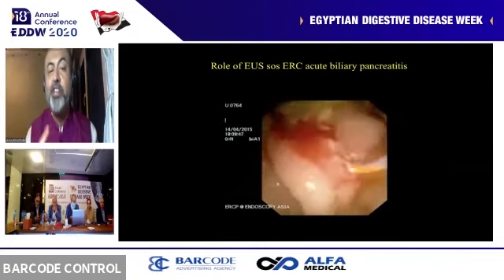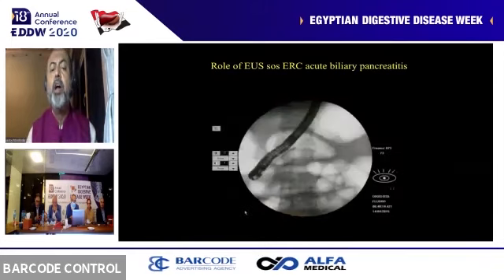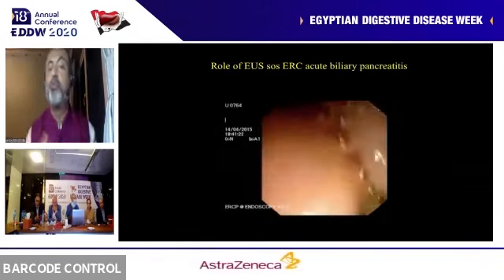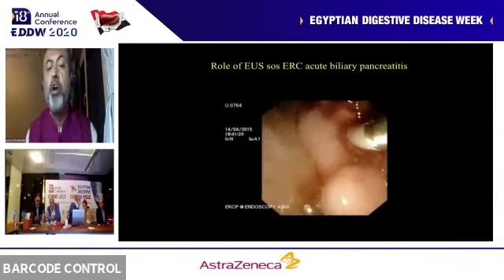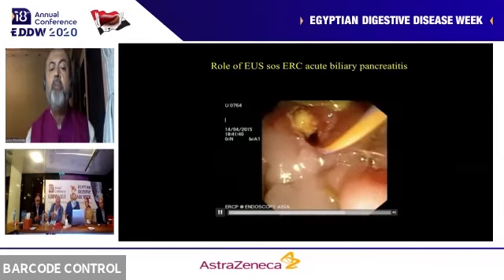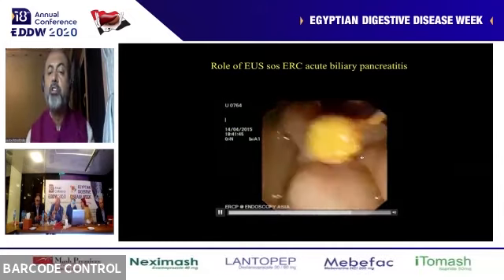So ladies and gentlemen, if you do a very high quality EUS, you can even avoid a pancreatogram or even a cholangiogram. And that's what I do for my obstructive jaundice, malignant biliary obstructions. We do not inject contrast anymore. We do EUS mapping. You see the stone, a classical cholesterol solitaire.